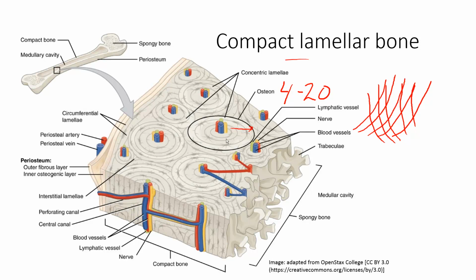So you have kind of these perpendicular helices. And if you were to look down in this osteon here, the type 1 collagen fibers in adjacent lamellae are running in opposite directions, and these perpendicular overlapping helices are going to impart a great deal of strength to the osteon. This is one of the ways that compact bone gets its high degree of strength, is the arrangement.